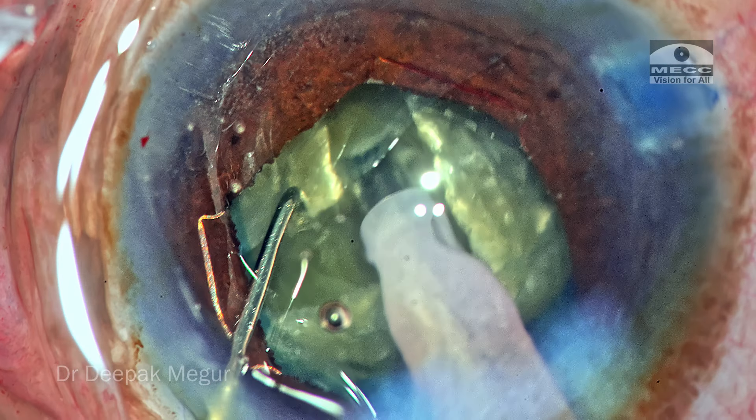Time to deal with the cortex. There is very little cortex remaining, but carefully, whatever minimal cortex is left is then removed.